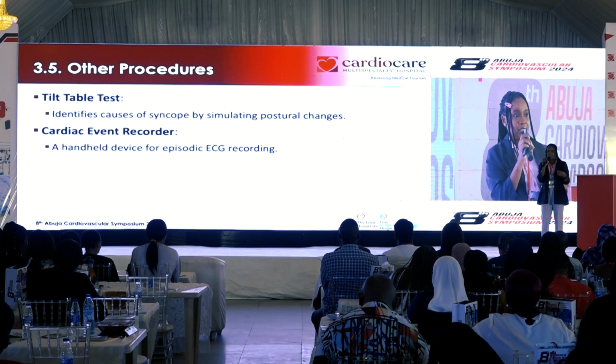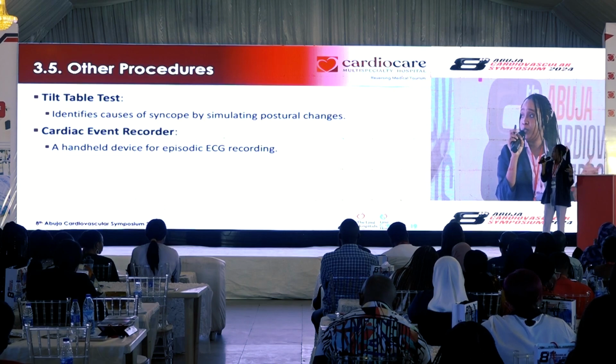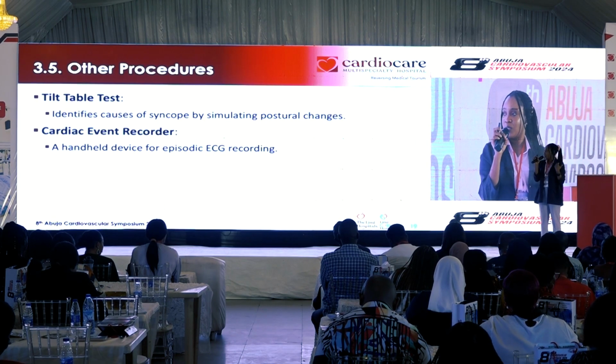So if they feel a particular thing, they attach it. It's proper to prep the patient's mind: if you're feeling a particular thing, you wear it on, and it takes longer readings for like 2 to 3 weeks. Okay, so some of the important benefits in clinical practice: early detection of life-threatening conditions.